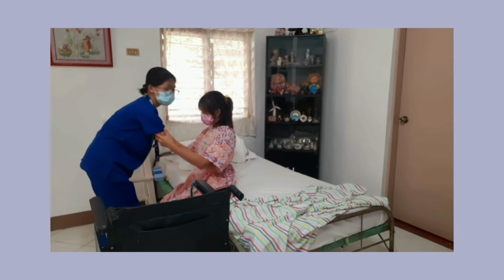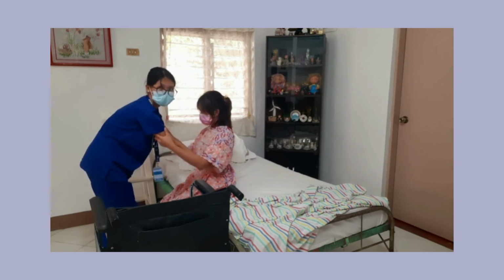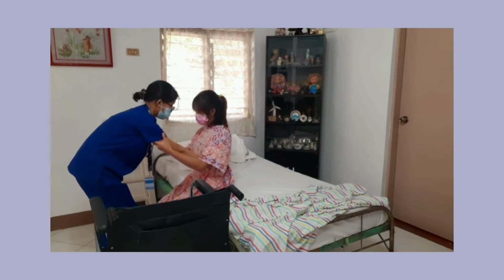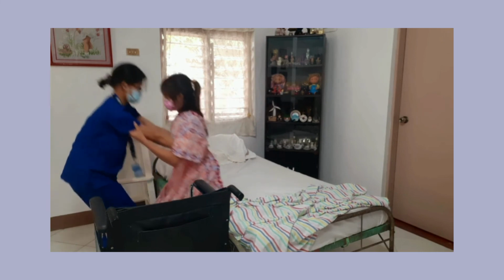Number 7, position yourself correctly. Stand directly in front of the client. Lean your trunk forward from the hips. Flex your hips, knees, and ankles. And then assume a broad stance, placing one foot forward and one back. Mirror the placement of the client's feet if possible. On the count of 3, ma'am, I would like you to stand. 1, 2, 3.